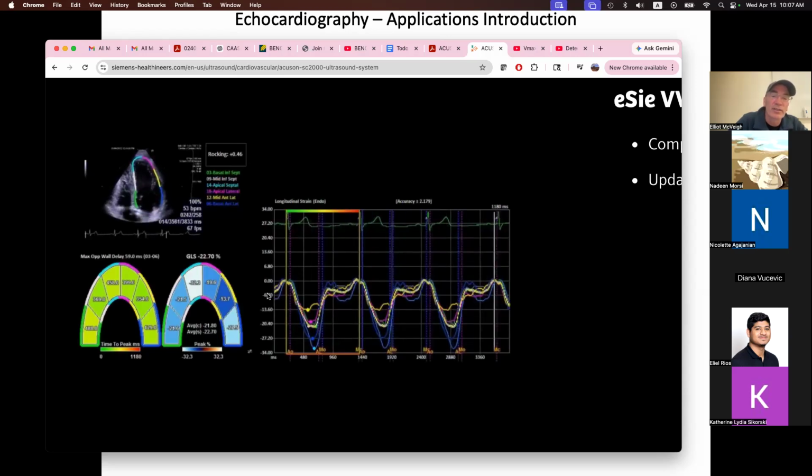And so you can see over time, they stretch a little first, and then they get shorter, right? And then it relaxes back to their baseline length, and then they stretch and get shorter. And so this rate of shortening down here and how much shortening we actually achieve at each point on the left ventricle is classic myocardial function.